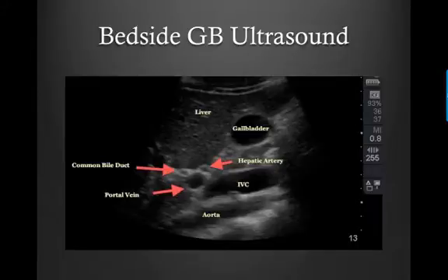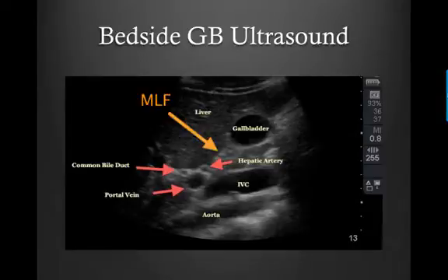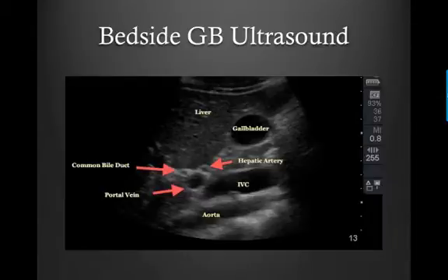Whenever you're ultrasounding the gallbladder, you want to make sure you're actually looking at the gallbladder. There are a lot of things near the gallbladder that can look very similar. So you want to locate your median lobar fissure, which is going to connect your gallbladder to your portal triad. That's a clue that you're looking at the gallbladder instead of, say, the IVC, the aorta, or bowel.